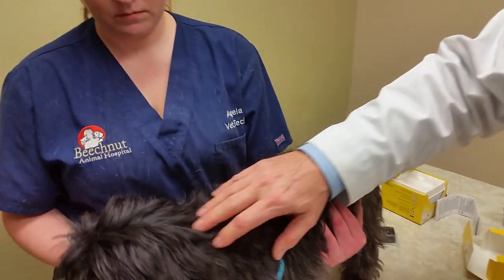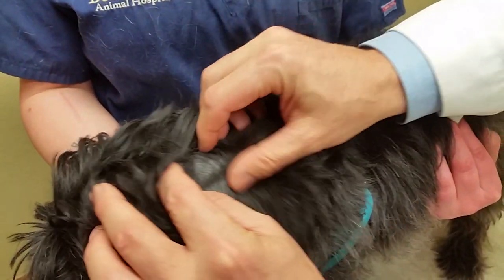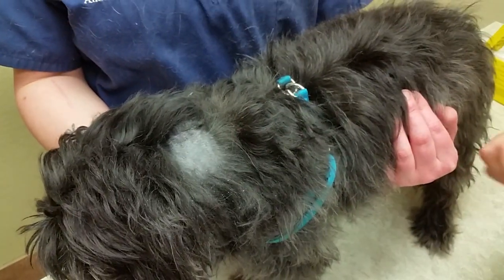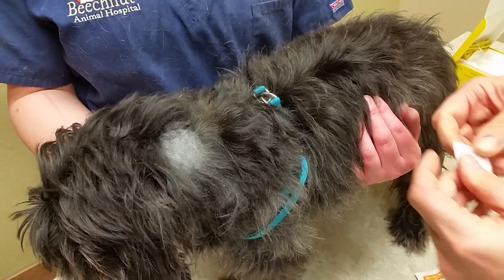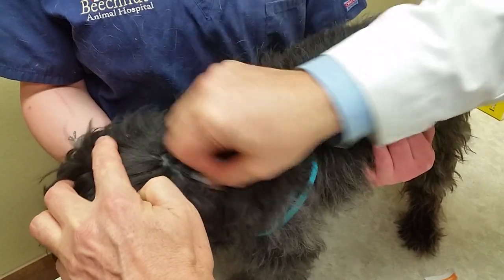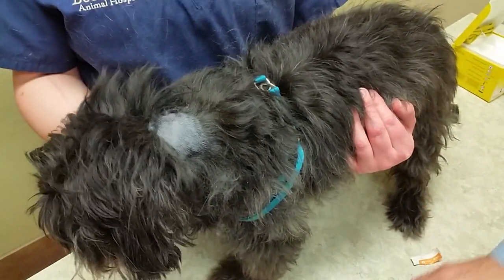First thing you want to do is clean and prepare the site where you're going to apply it. In dogs we typically apply it on the back of the neck. We've already clipped an area right here, and I'm going to clean it up with some alcohol — they supply these in the kit — and let that dry.